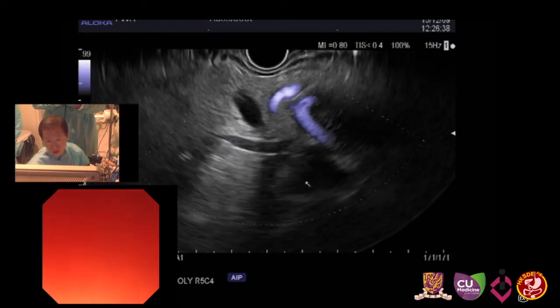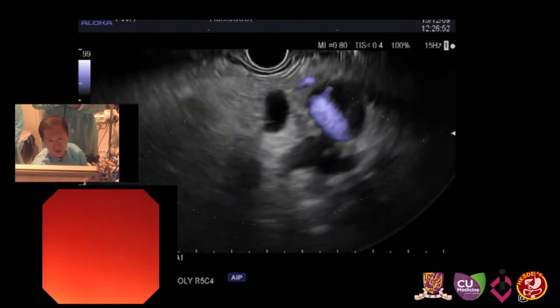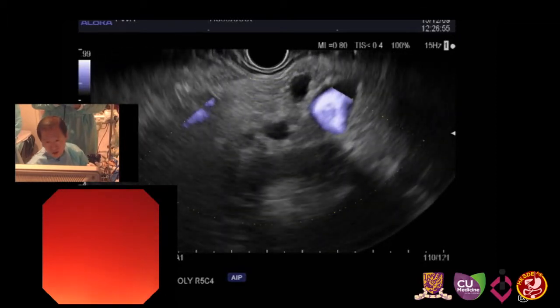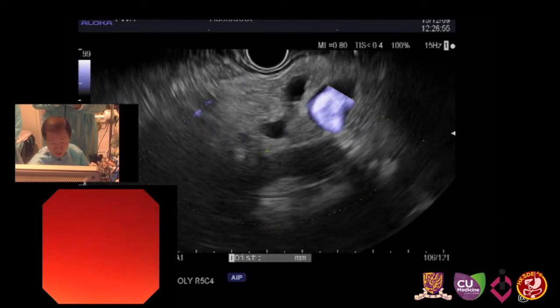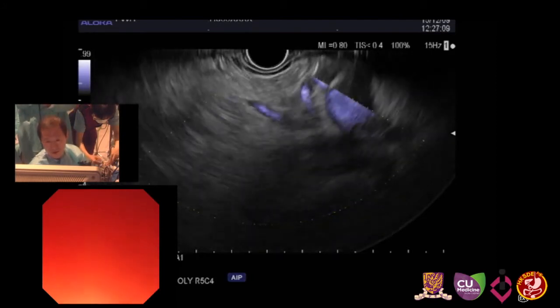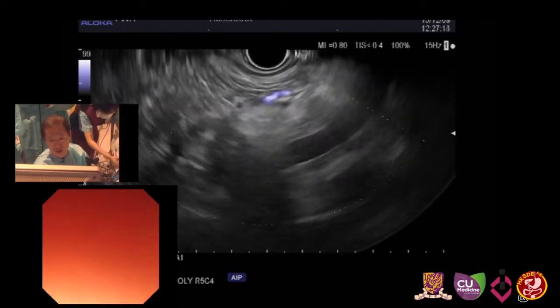This part, dilated extrahepatic duct, this is main pancreatic duct. It will merge on this area. That will be the duodenal area. And sometimes it is difficult to trace completely down. But even extrahepatic, the intrapancreatic CBD shows the dimension is about how much? 8.8 millimeter, not very much dilated from this view. But we will see. This area will be the duodenal part.